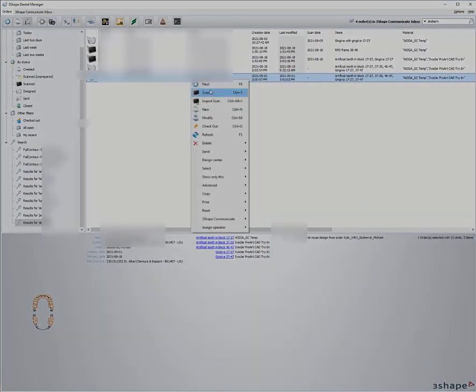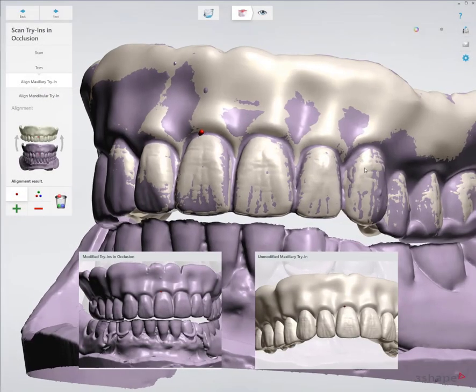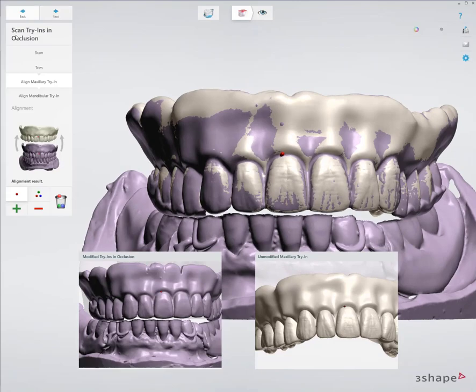I'm going to close those and I'm going to scan this again. Now once it's scanned in, I'm going to align the upper like normal.